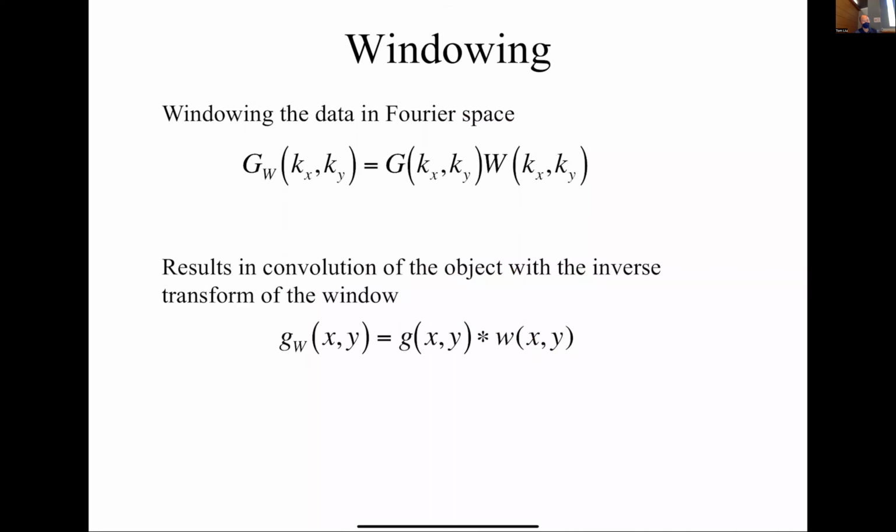Okay, so that's basically all, and we'll revisit the design problem in a minute in terms of applying this to actual pulse sequences. But the next thing we need to talk about is windowing the data. And this is the idea that the Fourier transform is defined from -infinity to infinity, right? But obviously we don't want to do that. We want to be within some regime.